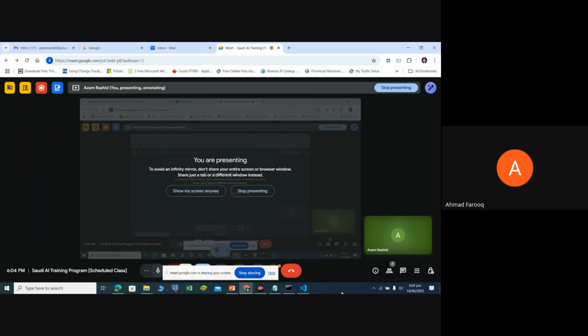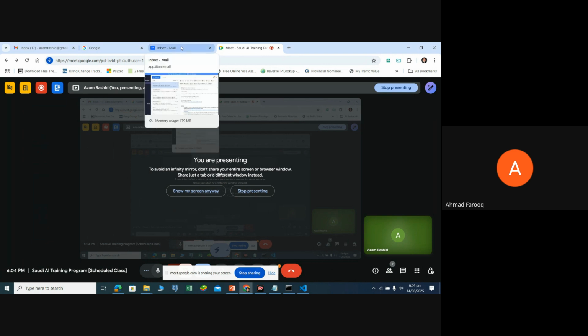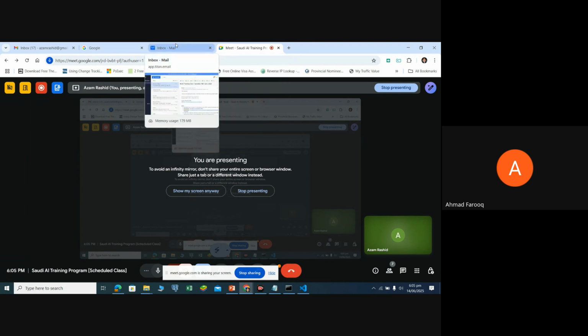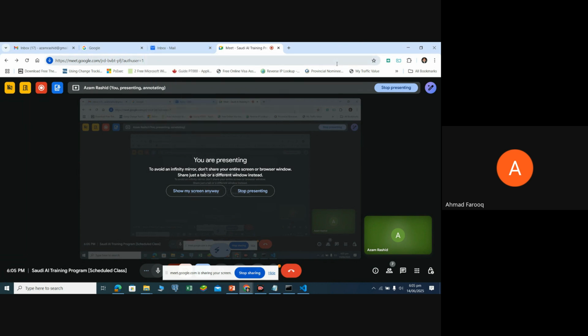But they have to go to one tool for one specific process, like for example segmentation or intensity normalization, and then they have to go to another tool for another process. What we are doing for them is giving them one single tool which takes care of all these processes simultaneously in real time, and it makes life a lot easier for them.